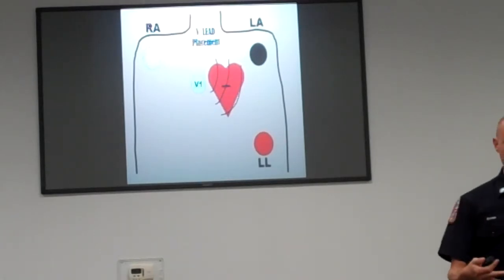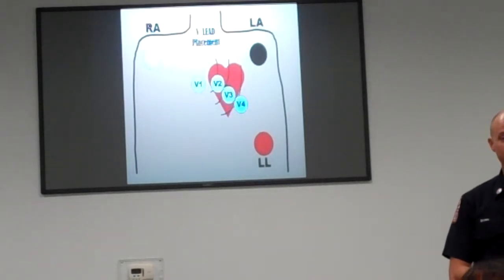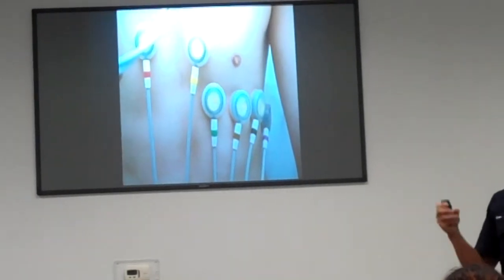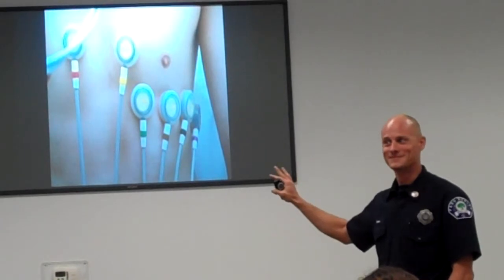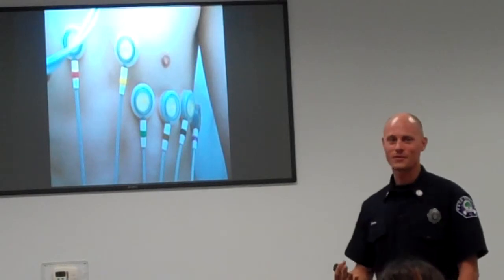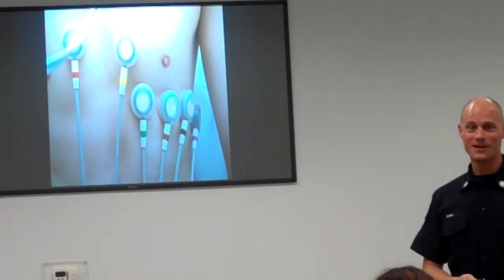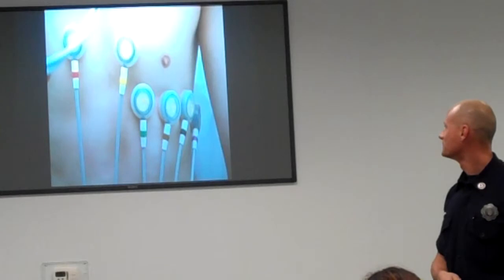Okay, and to beat a dead horse, we're going to look at that. So again, I go V1, V2, V4, I drop V3, and then go 5 and 6. So even my little animated drawing here is incorrect because it should be going up, right? This one, I started off by putting in as a good example, and then I realized there's something wrong with it. Drops down. Yeah. There's two things wrong. Yeah, there's V3. Look at V1 and V2 too. Yeah, it's pretty ugly. So we could probably clean that one up a little bit.